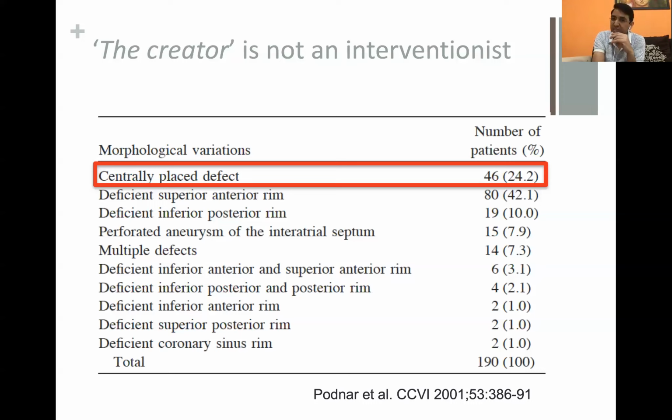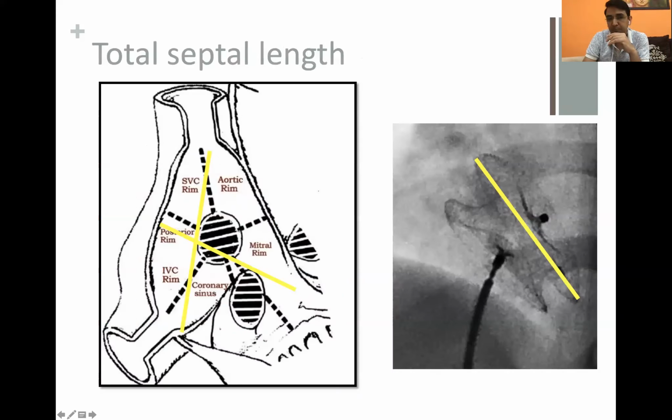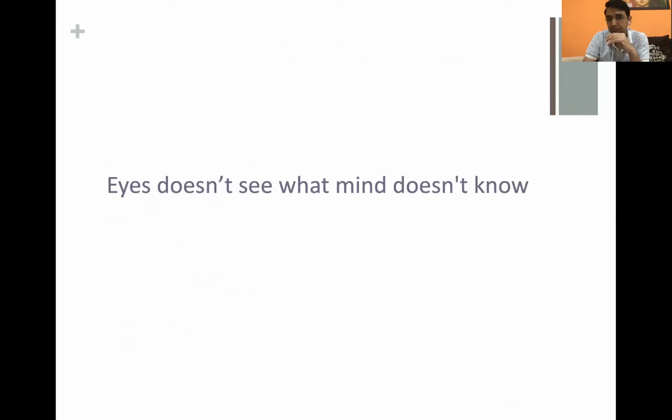Once we see a few of those, we become wiser about how to handle that situation, how to manipulate that. So I wanted to emphasize that. Actually, the orientation of the catheter sheath assembly from the inferior vena cava is never completely perpendicular to the plane of the intra-atrial septum, and so in larger ASDs, it is quite common, especially when they have deficient margins.